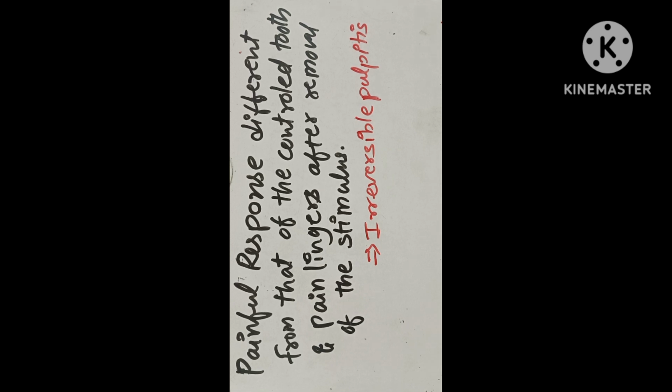If there is no response after applying the stimulus or heat, it indicates that the pulp may be non-vital or the pulp is dead. However, the heat test is not very reliable and should always be compared with clinical and radiographic findings. Heat testing is recommended when the patient's chief complaint is pain on contact with any hot liquid or food.